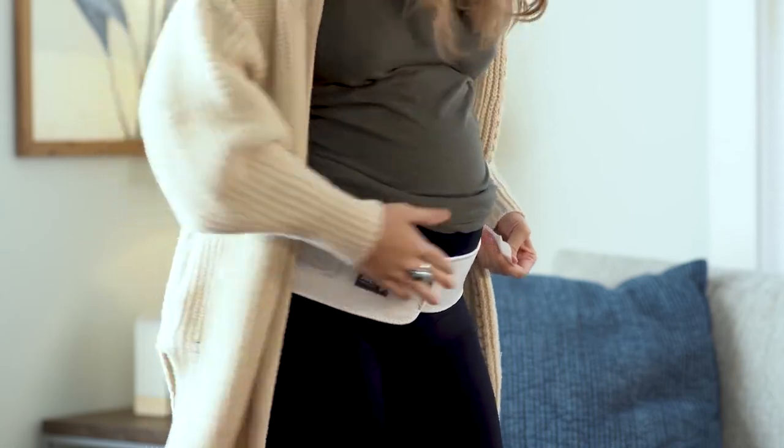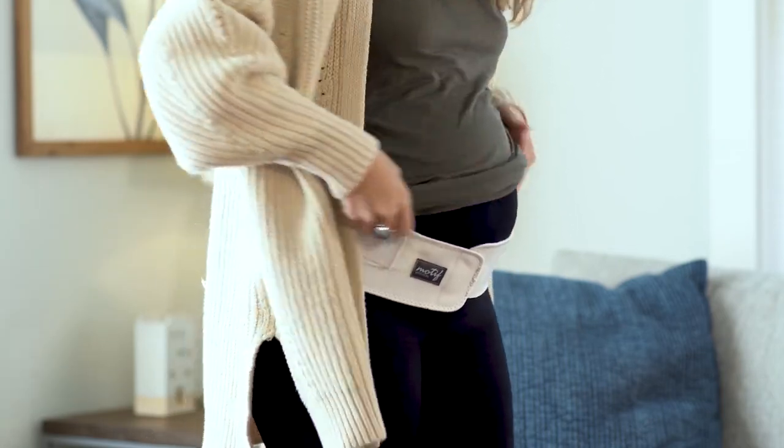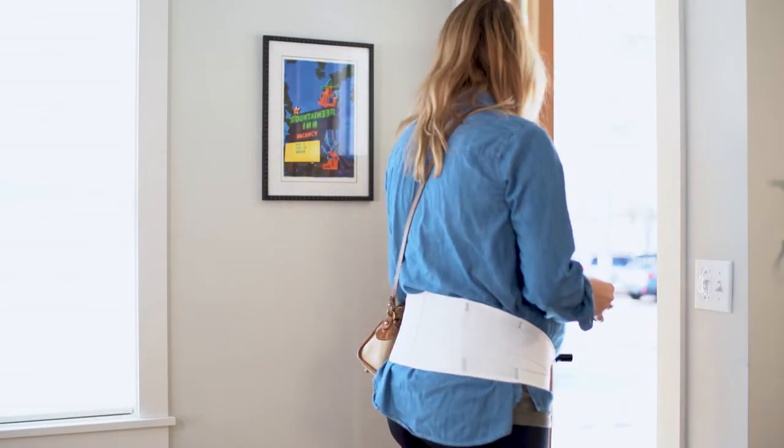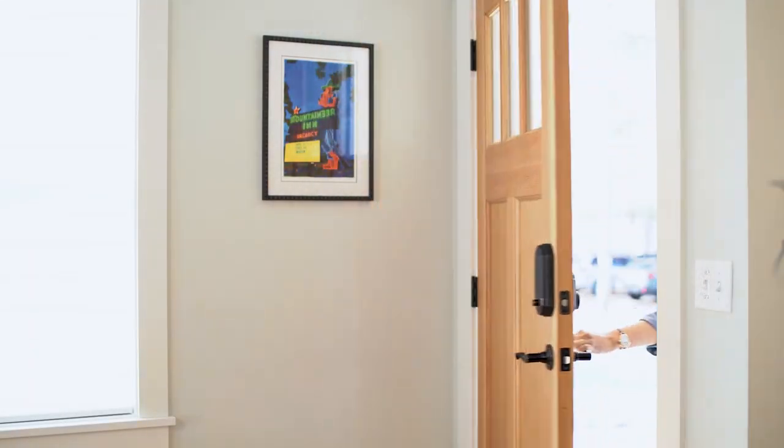Choose your desired support, compression, and fit by simply adjusting the side tension straps. That's it! You're now ready to wear the band underneath your clothing or over your clothing.